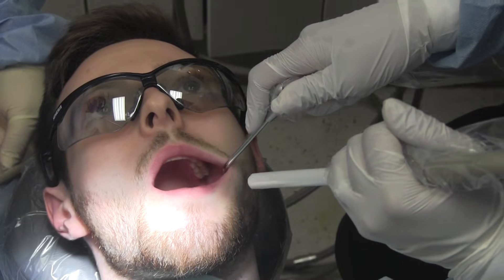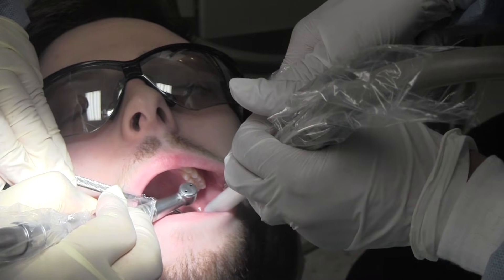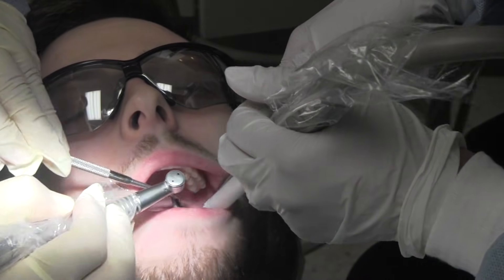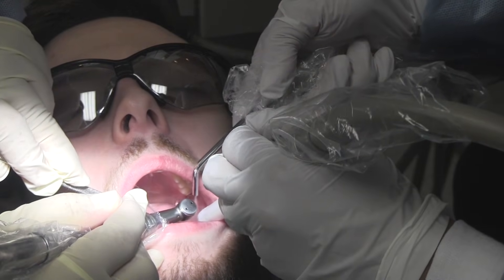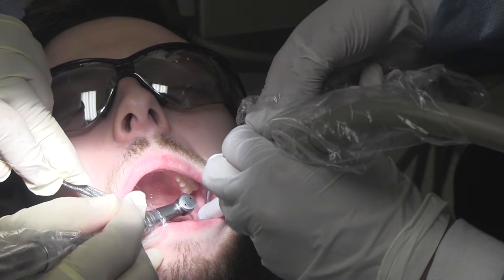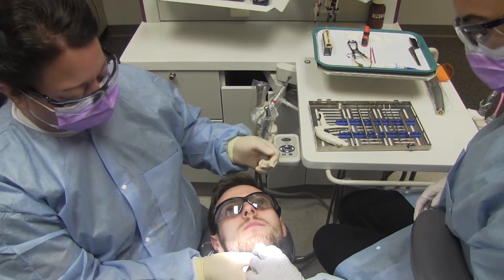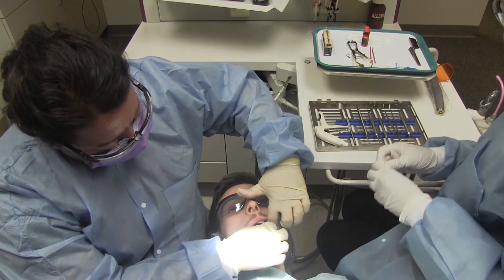Gently retract the patient's cheek and or tongue away from the treatment area while suctioning to provide a clear line of vision and ample space for the dentist to work as the tooth is prepared. After the dentist has finished preparing the tooth and cleared all decay, rinse the tooth well and air-dry. Maintain a dry field by placing cotton rolls, gauze, or dry angles at the site to prevent the buildup of any moisture.